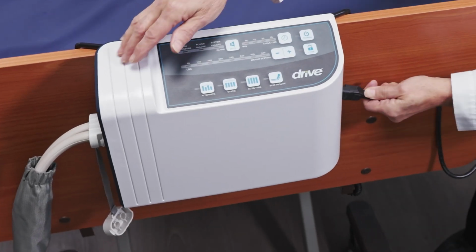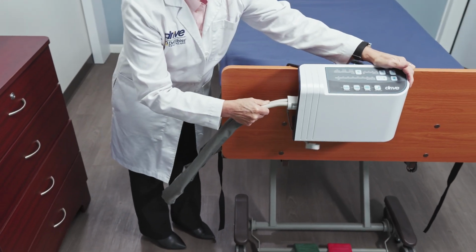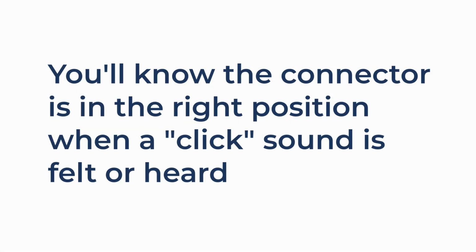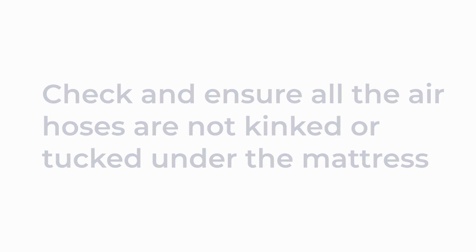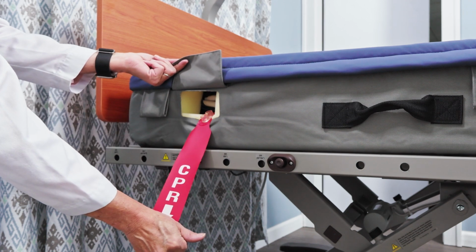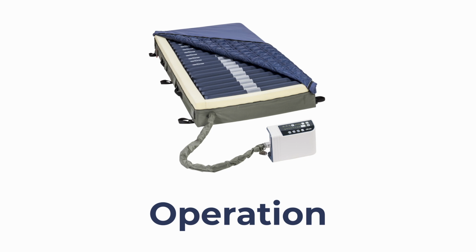Push the power cord into the power socket and plug it in. Connect the Easy Lock connector from the Preserve Tech MedAire Edge air mattress to the control unit. You'll know the connector is in the right position when a click sound is felt or heard. The control unit is only operable when the Easy Lock connector is connected to the system. Check and ensure all the air hoses are not kinked or tucked under the mattress, and the CPR strap on the left side by the headboard is fully attached. That's it. Installation is done. Let's move on to operation.